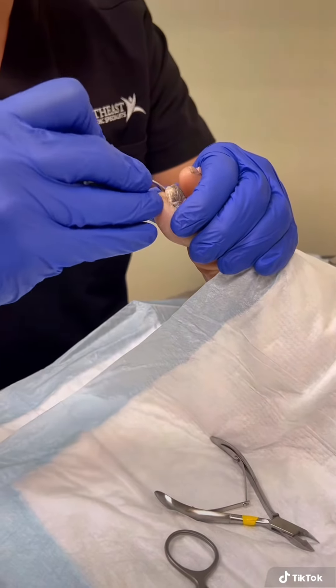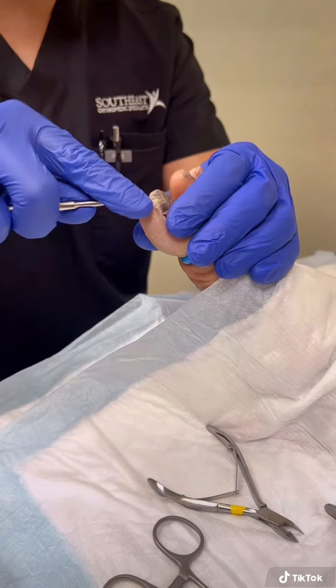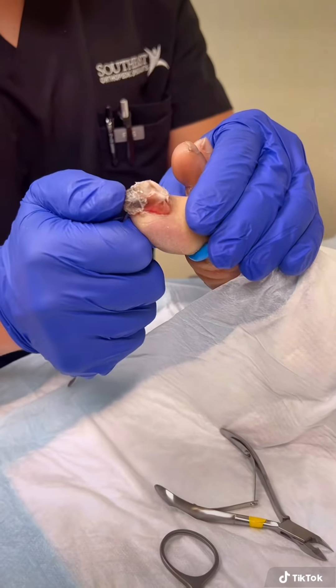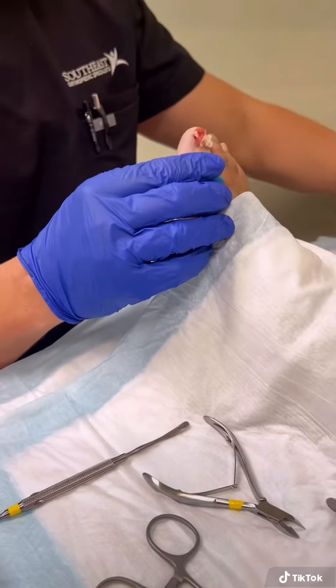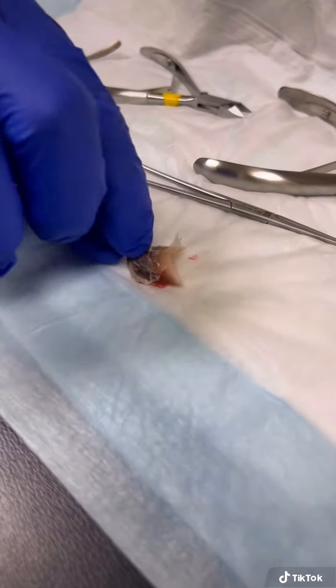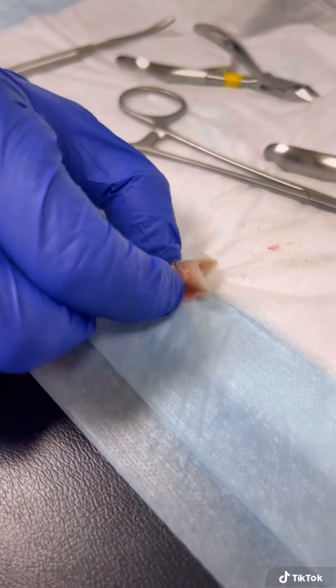So we got one side that's pretty loose. And now you just lift the nail and it comes right off. You can see the nail — if you zoom in — it had all those attachments.